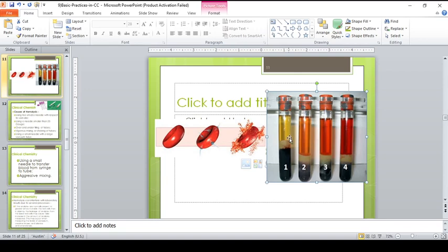Lalabas sila. Saan sila pupunta? Pupunta sila sa serum or sa plasma. In that case, what will happen? That will lead to increased levels of those analytes. Tataas yung level nila. Is that normal? Of course not, kasi that will lead to false increased levels of analytes.